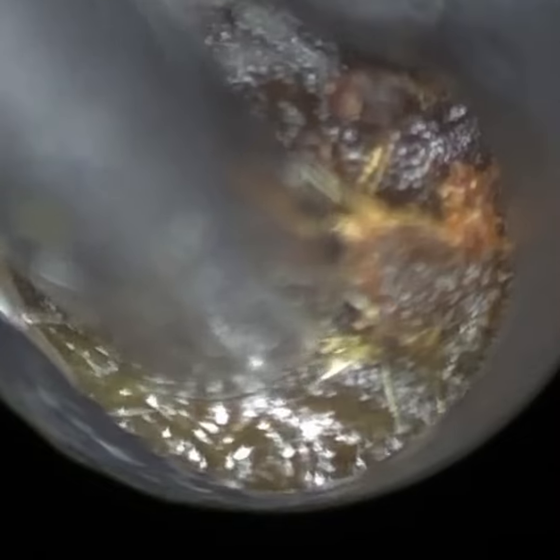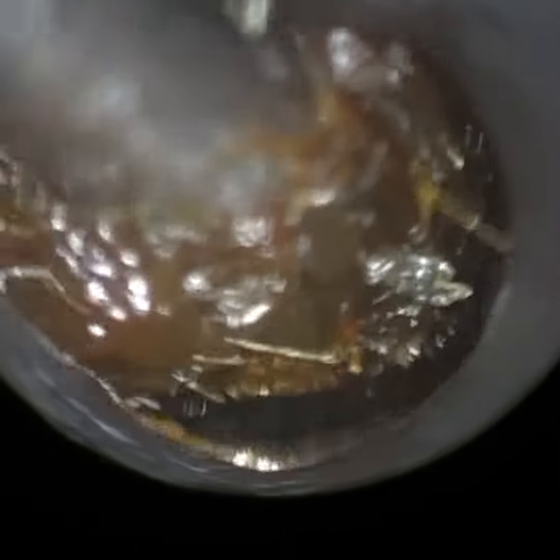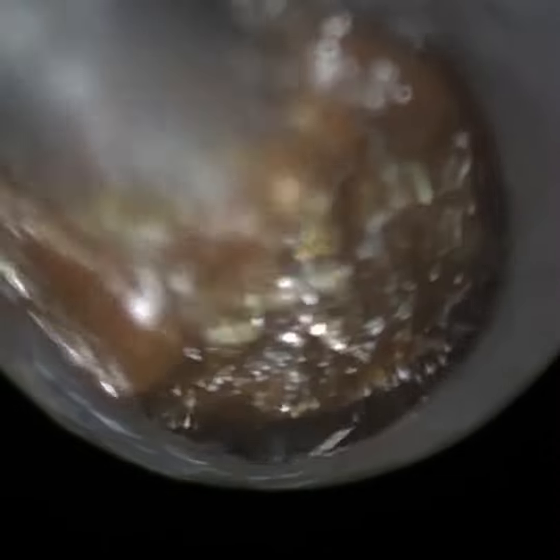I'm just trying to go around the periphery of this wax plug — you can see it's really impacted. In a moment I'm going to revert to an ear hook, and the ear hook does come to the rescue. The oil softened the lateral surface of this wax, but once that softened layer has been removed, you've got another layer — so it's one of those procedures where you have to be patient. I've got it more mobile now; it's no longer attached to the canal walls, the skin adhesions have been removed, but it's still somewhat tricky bringing it out of the ear.